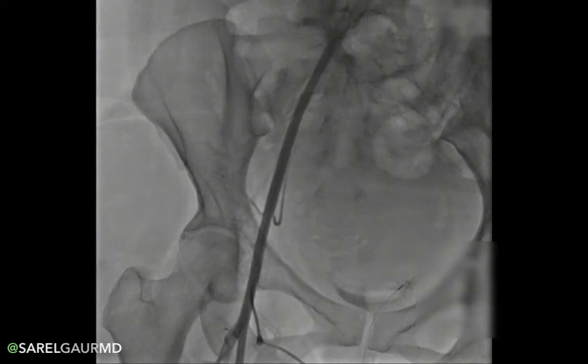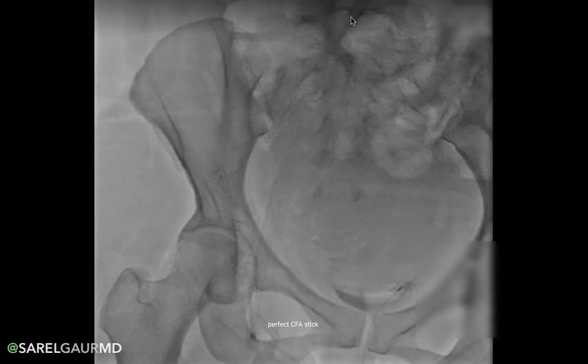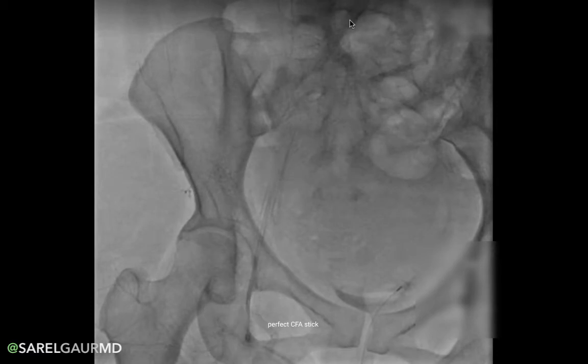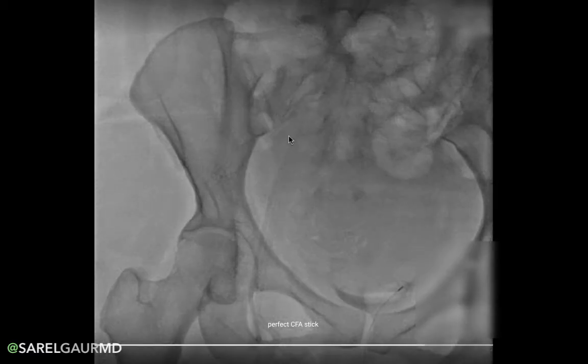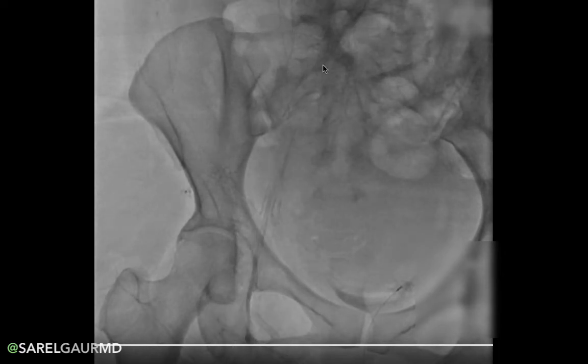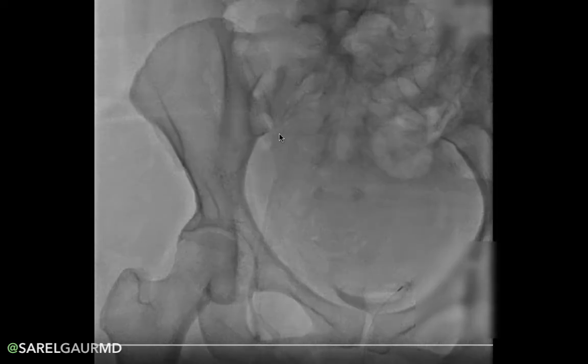So finally, let's break down this angiogram. Here at the very top aspect of the screen, we have the common iliac artery. It's named common because it's common to both the internal iliac artery and the external iliac artery. Here we can sort of see the internal iliac artery branching off — you can see a nice prominent branch of the internal iliac artery, which is the superior gluteal artery.